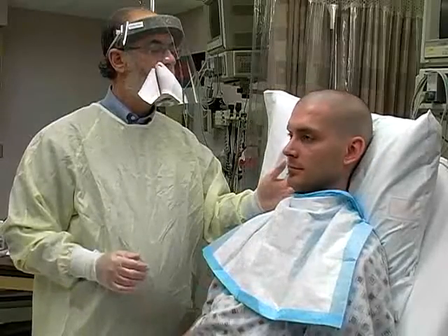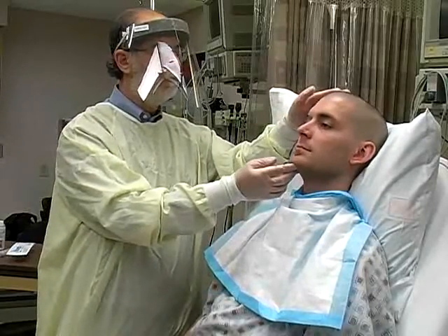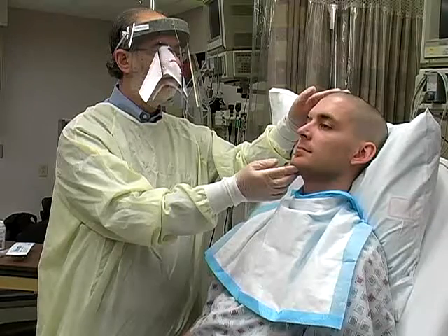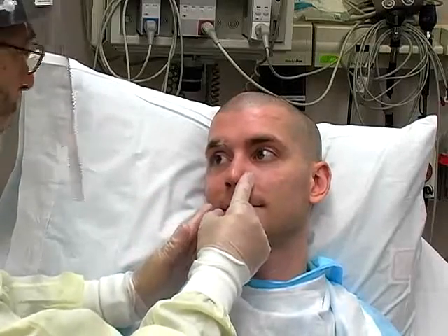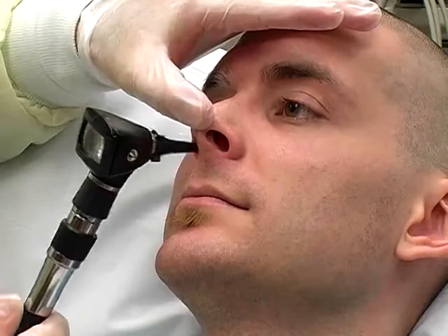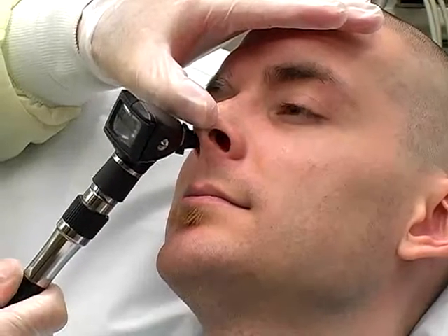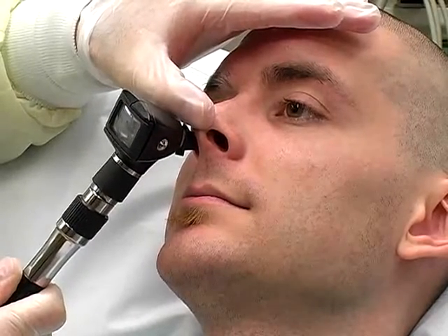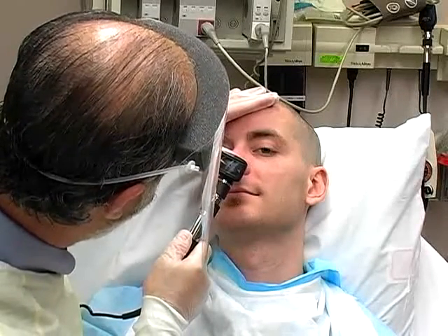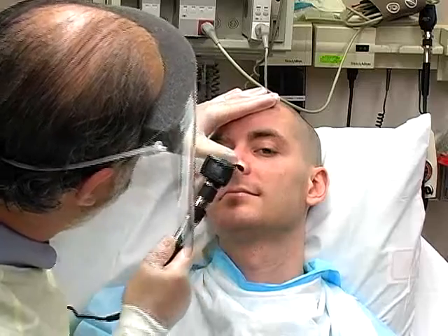Position him sitting upright in the bed. Place his head in the sniffing position, with the neck slightly flexed and the head slightly extended. Assess the patency of the nasal cavities by instructing the patient to inhale through each nostril individually and asking him if either provides better airflow. Visualize the nasal passageways with an otoscope to evaluate for septal deviation or other impediments to tube insertion. Choose the appropriate side for nasogastric intubation based upon these observations.